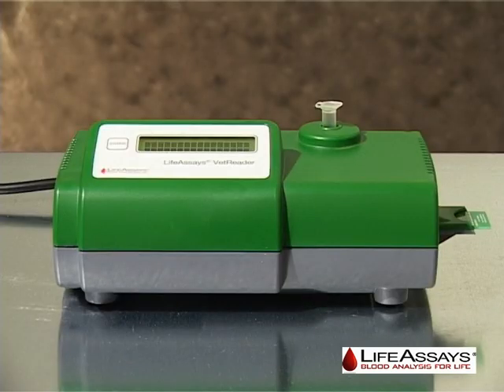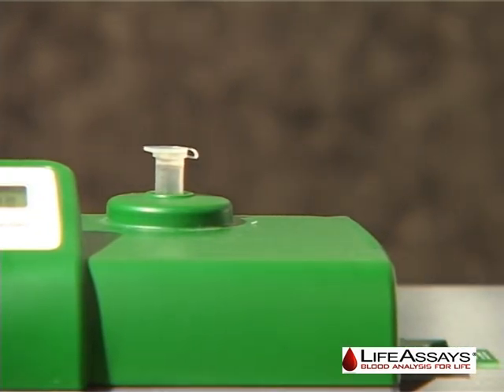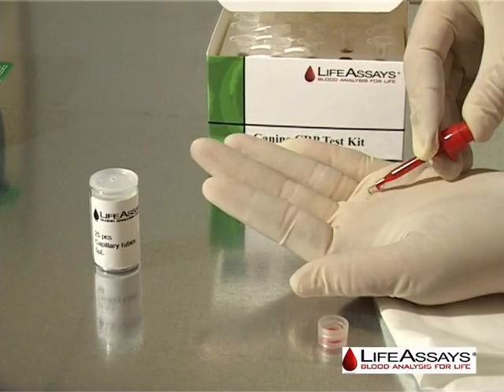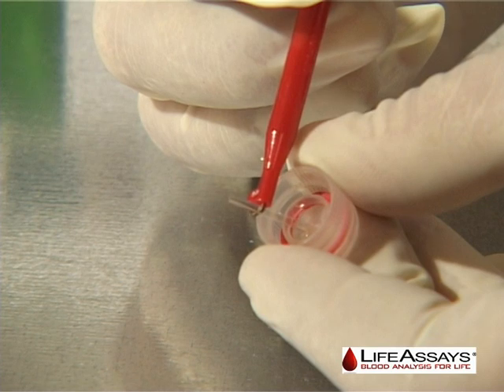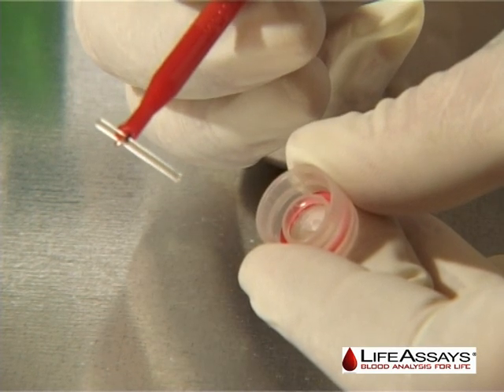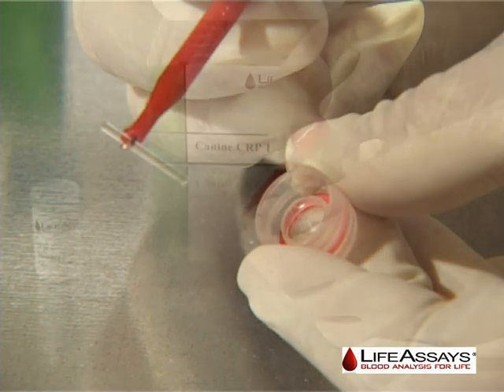As long as the vial remains loaded in the instrument and collect and add sample is displayed, the user has plenty of time to collect the sample. Collect a 5 µL serum or plasma sample using the glass capillary provided with the reagent kit. Be sure to use the capillary holder for capillary handling and not your fingers. For accurate results, avoid the introduction of air bubbles into the glass capillary and be sure to fill the entire length of the capillary with serum or plasma.